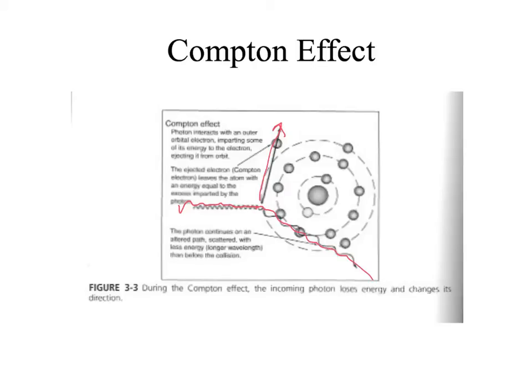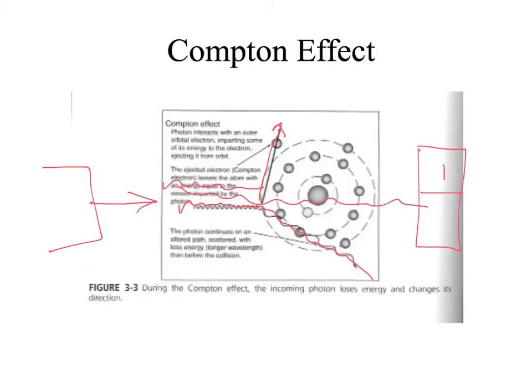The significant thing about this is, let's pretend that over here is our tube that's emitting X-rays, and over here is our receptor that's receiving X-rays, and this is like a bone in the patient's body that has this atom in it, right? We want either the X-ray to strike this thing and stop, and then show up as like a 1 on our receptor. It has an attenuation value. Or we want it to pass straight through it and darken the receptor, right?